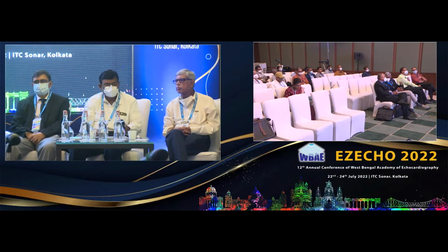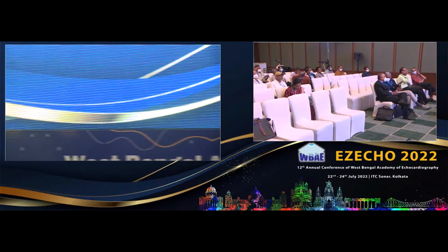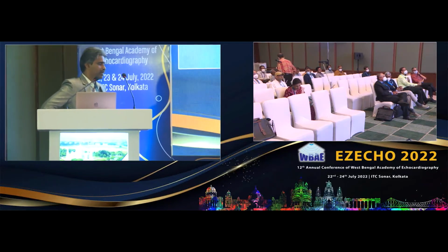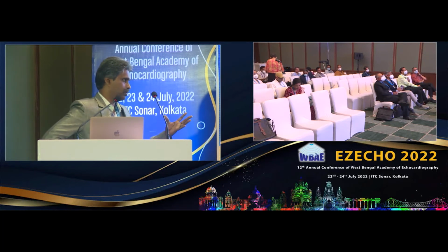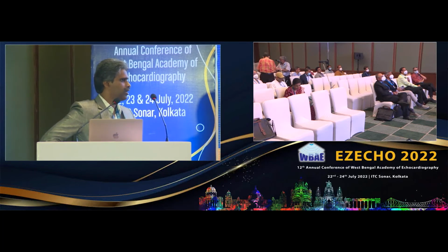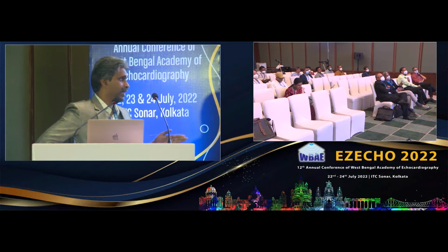Yeah, so this is one area where a lot of studies are happening now in the emergency department. If we can do a CT where we can clearly demonstrate that the lumen is normal and there are no high risk plaques, I think the studies have shown that the admission rates and the hospitalization days are very, very less. So most of the patients can be discharged, especially if the high sensitive troponin is also normal.